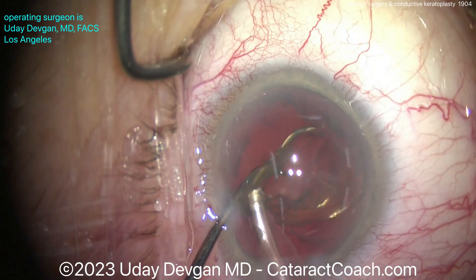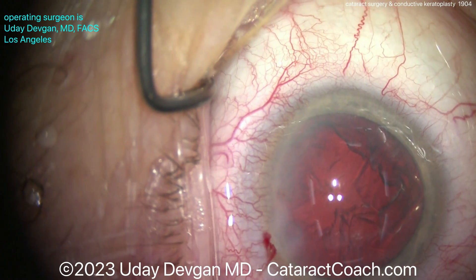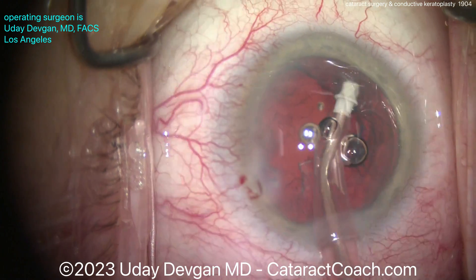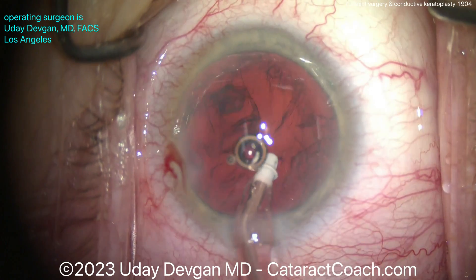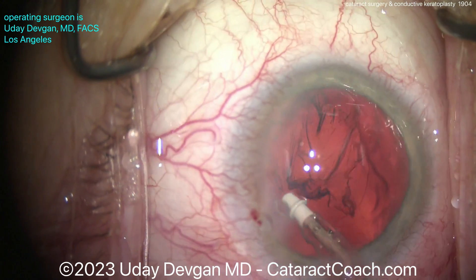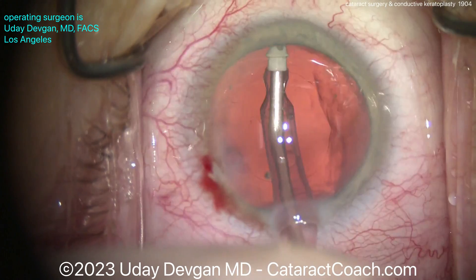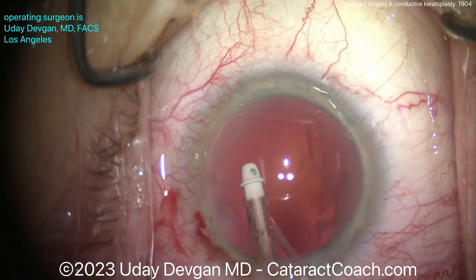Step two: remember these patients tend to have hyperopia — they've been hyperopic their whole lives, that's why they had CK done. Like this patient, a latent hyperope of about plus two, who after CK shifted to about plus a half or plus one. At age 45 with some remaining accommodation, this eye could do great reading while the untouched eye handled distance. Look at both eyes together and compare — usually CK is done to only one eye. Compare the two eyes and see the differences in corneal powers. In this patient, the K value in this eye was about 0.75 diopters steeper than in the other untouched eye.